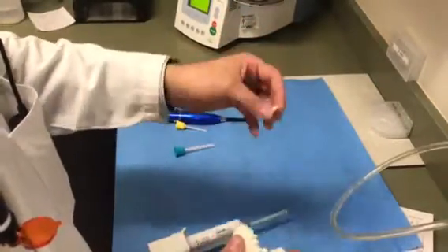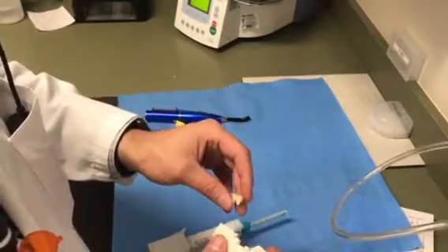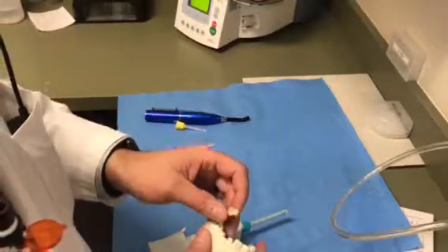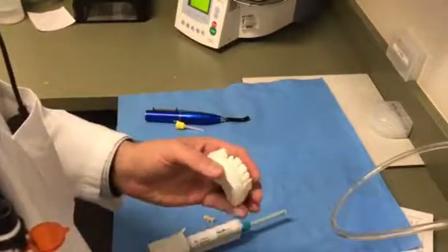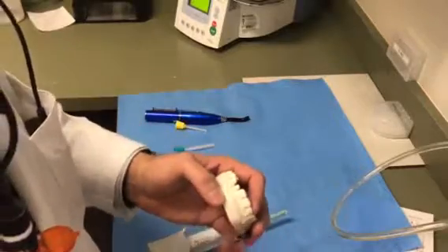Let's just say it's a quarter of a millimeter, just enough that light's coming through there and you can pass floss through without it touching. So my first method to communicate it with the lab is how far open it is: I get my model to match the mouth. So you start with the model not matching the mouth.